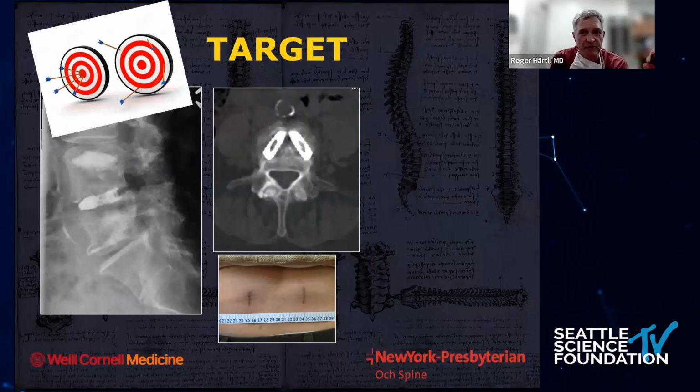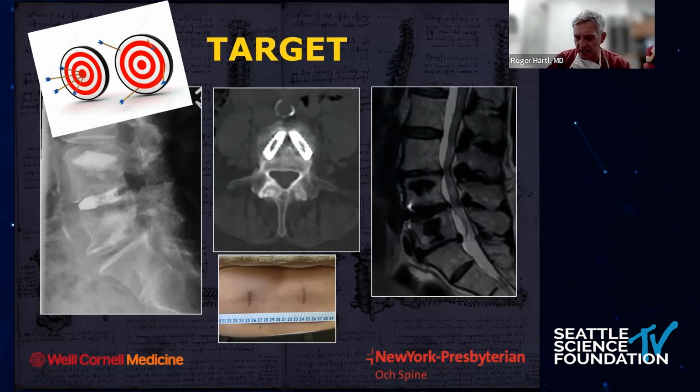This patient came from Europe. She had surgery done a year before I saw her, and had essentially presented with the same pain that she had before surgery, neurogenic claudication, no mechanical back pain. These were the x-rays, so they put cages in percutaneously, they put bone cement for some reason, and she fused. She had a great fusion, but she had the same symptoms that she had pre-op, neurogenic claudication. So the MRI scan showed that she still had stenosis here, and now she had adjacent level stenosis as well.